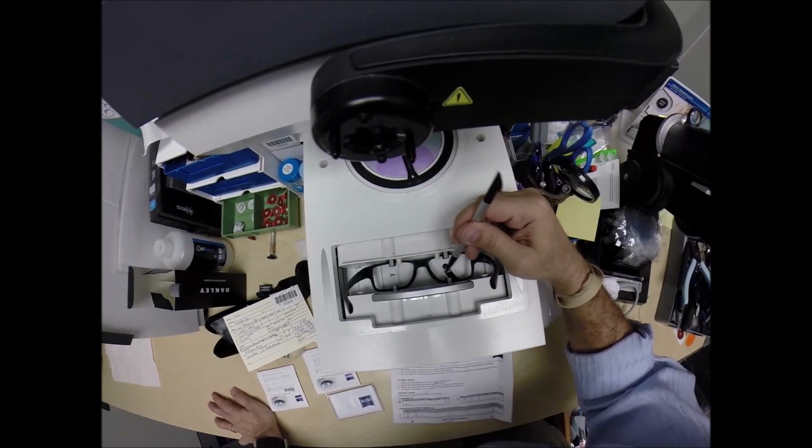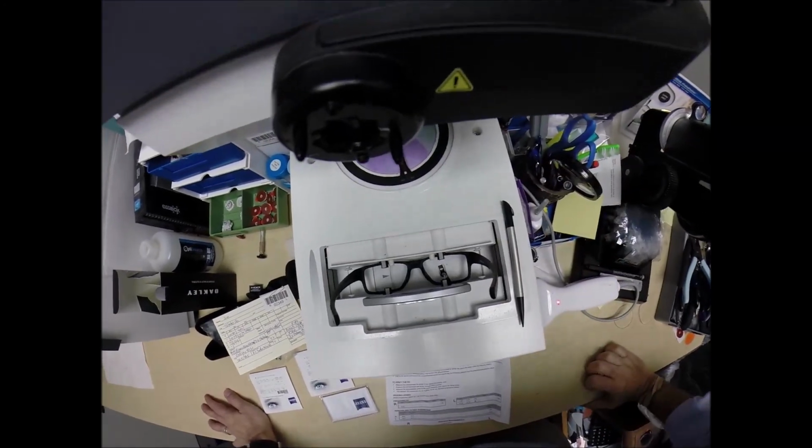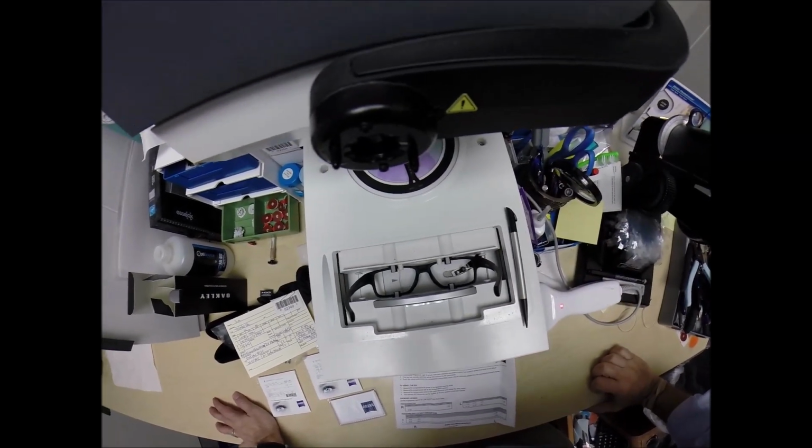I'm going to hit the start button. The stylus is going to pop up, go around, trace the inside bevel of the frame before doing the same thing on the left-hand side.